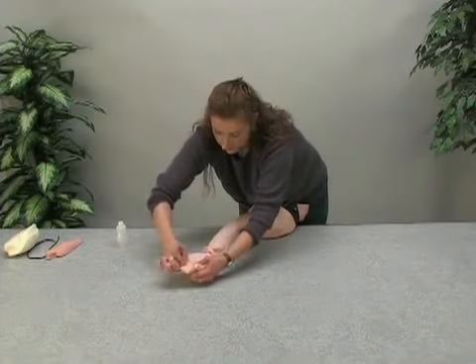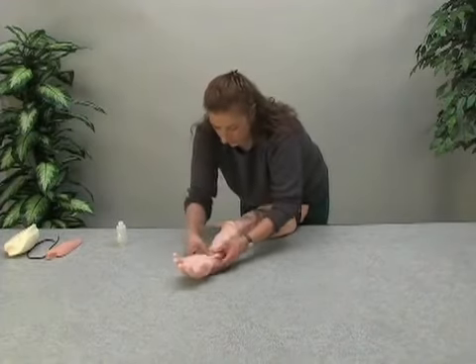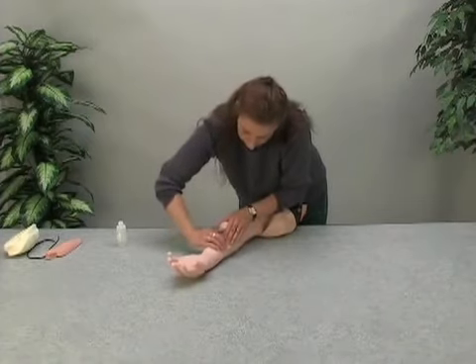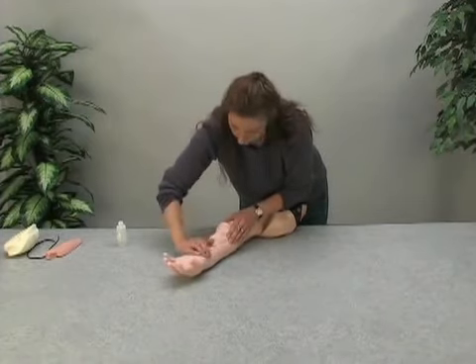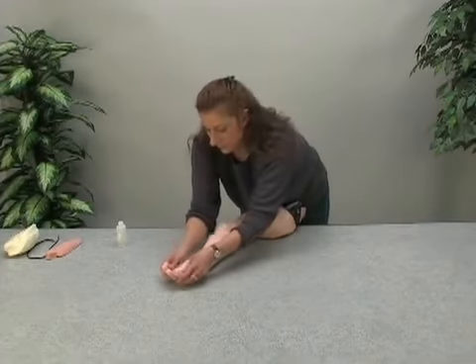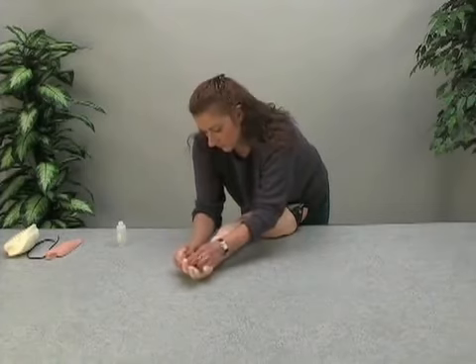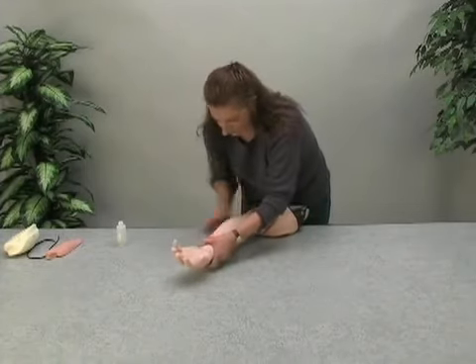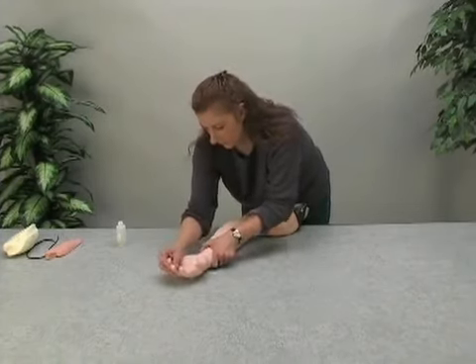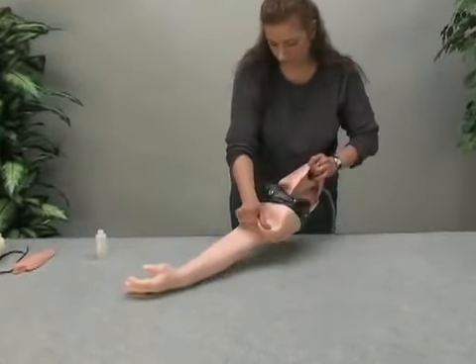After the fingers and wrist are properly placed, massage the skin over the core for a snug fit. Feel along the tubing channel to make sure the tubing is correctly seated. Tubing that has moved can usually be moved back into position by working on the outside of the skin.